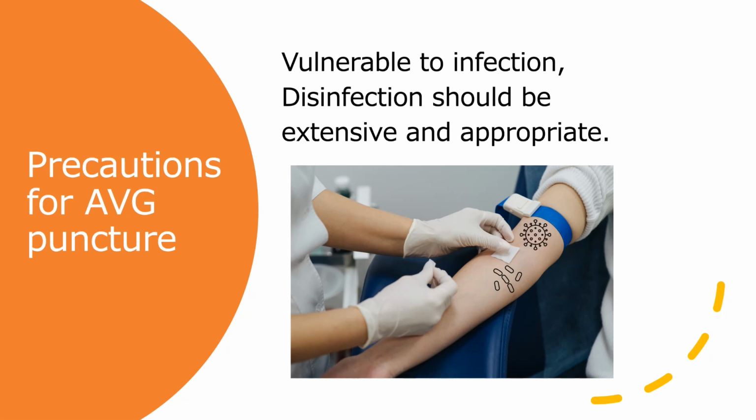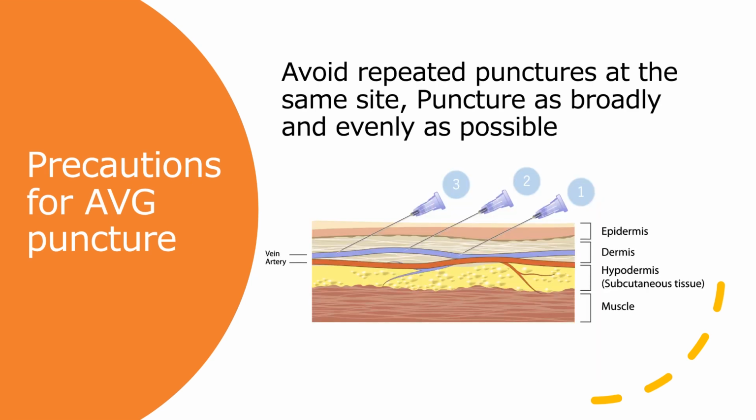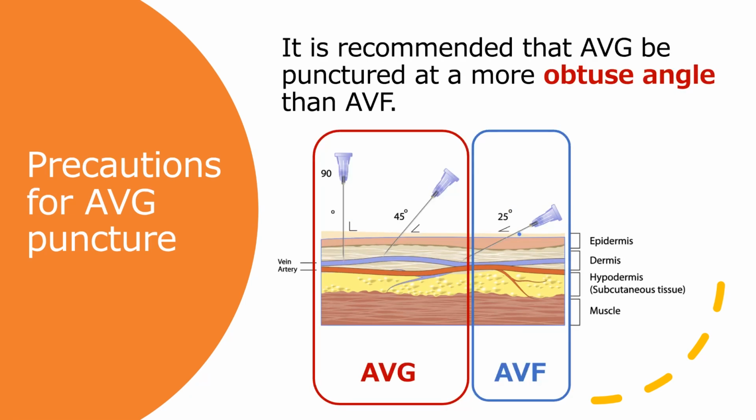AVGs are more vulnerable to infection than AVFs. Disinfection should be extensive and appropriate. As with AVF, avoid repeated punctures at the same site and perform punctures as widely and evenly as possible. It is recommended that AVG be punctured at a more obtuse angle than AVF.